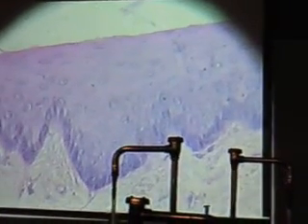You can see the nuclei all the way to the free surface, all the way up. What's this down here? Basement membrane. What's that basement membrane made of? Collagen fibers. Glycoproteins, but primarily collagen fibers.